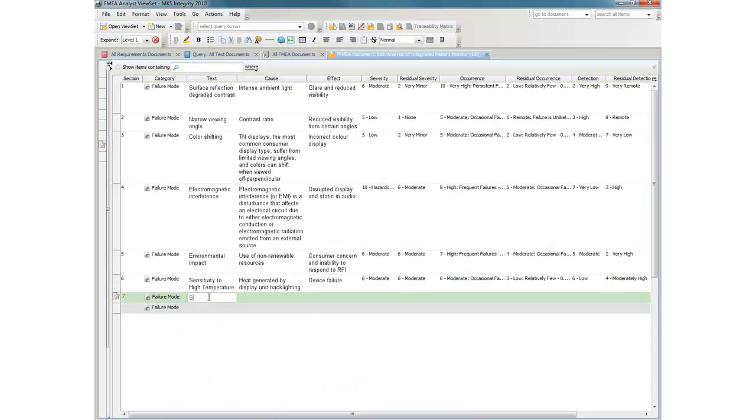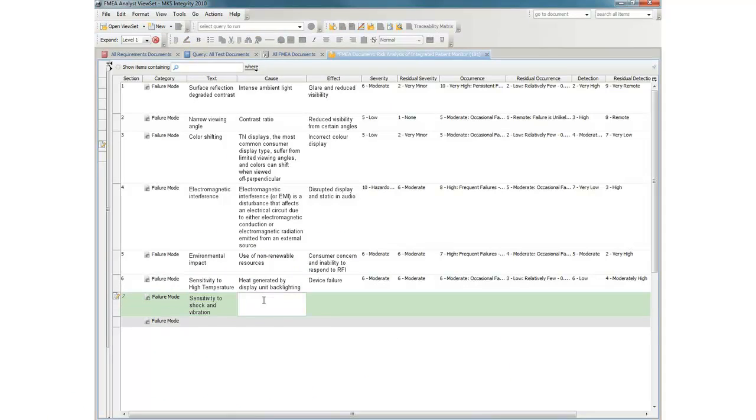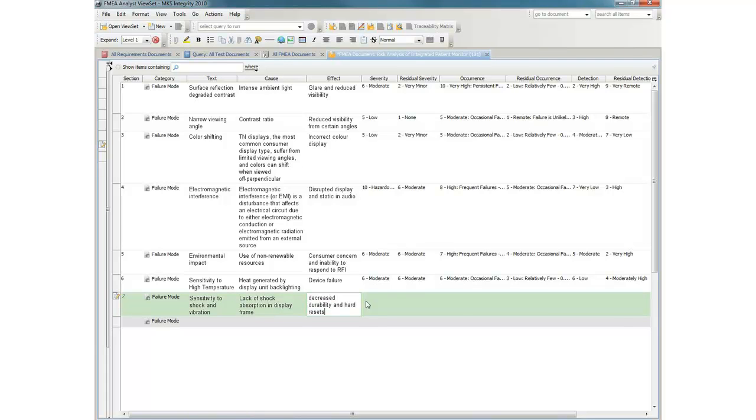MKS Integrity supports the concepts of Failure Mode and Effect Analysis, or FMEA, as part of our default configuration for medical device implementations. Let's add a new failure mode to this document.